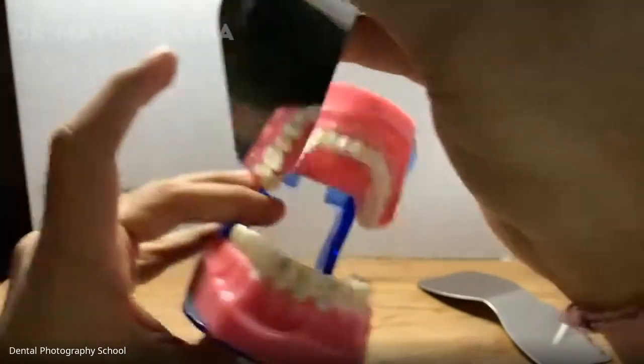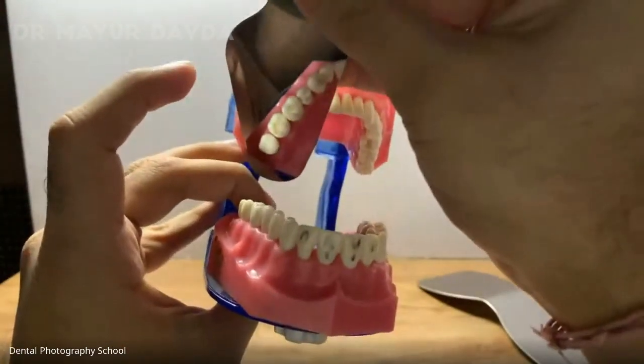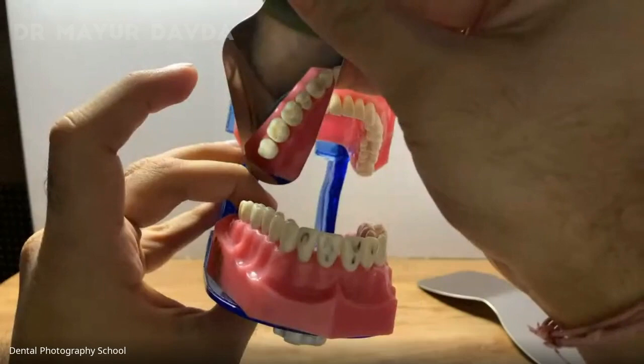If you are recording the 6th quadrant, it will be like this. I'm at the 12 o'clock position and I'm recording like this. However, if I'm going to... and if I want to record the 1st quadrant, I'll keep my mirror on the 1st quadrant.